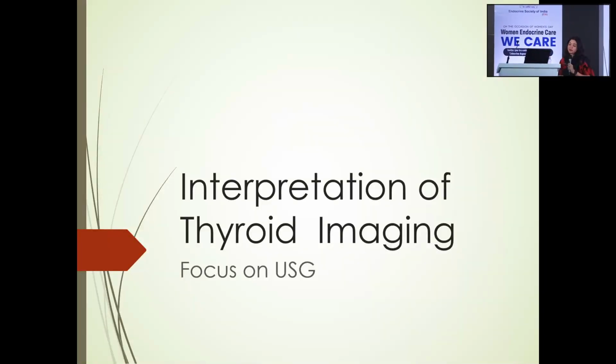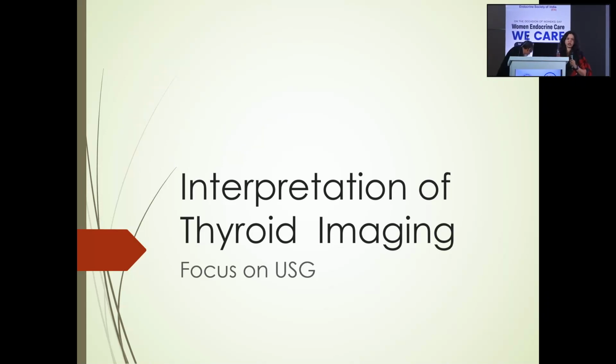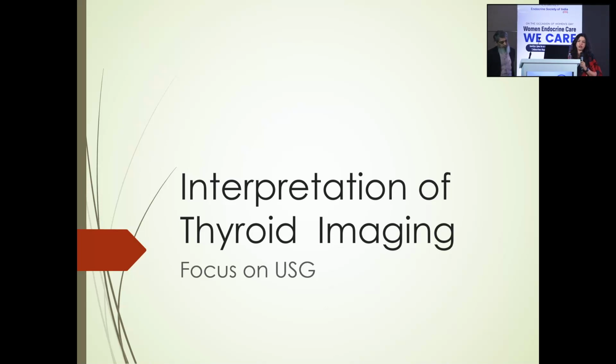Good morning, everyone. This session is going to be a duologue where we'll be discussing the interpretation of thyroid imaging, but we'll be focusing only on ultrasound, because that's very important when we do any diagnostic test before we go for any FNAC for a thyroid nodule. An ultrasound is the basic modality which is needed. So, Dr. Asif, you're there, yeah, please.